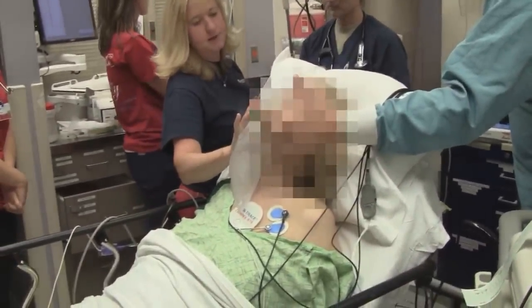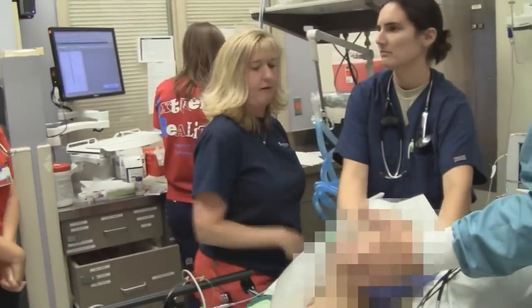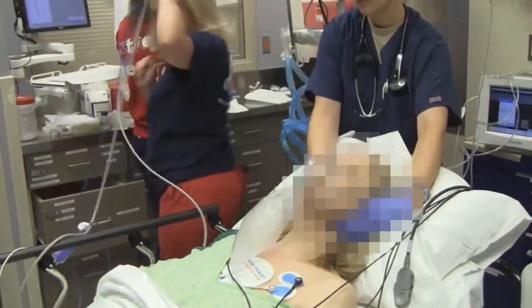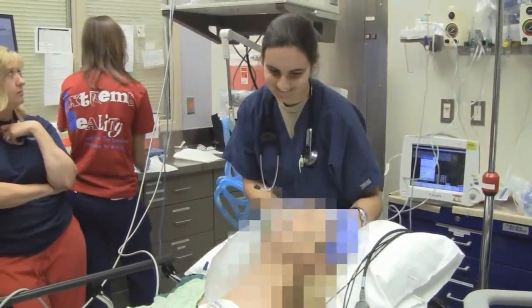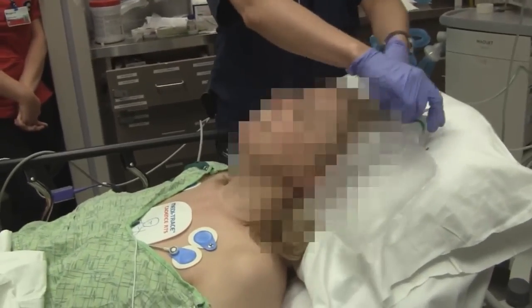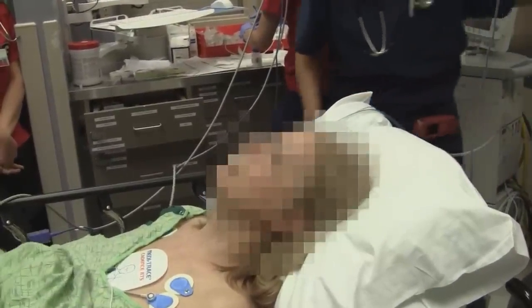Peggy? We're done. We're coming back. Hey there. Did you zap me? We zapped you. You guys are awesome. I'm going to repeat the EKG, okay? You didn't feel anything at all? I didn't feel anything. Perfect.